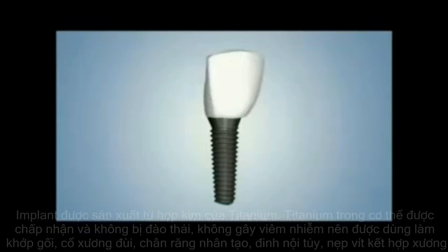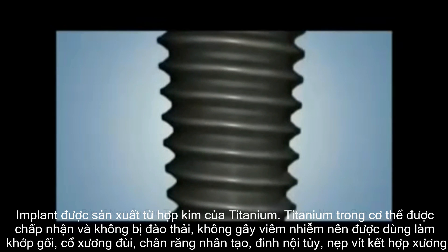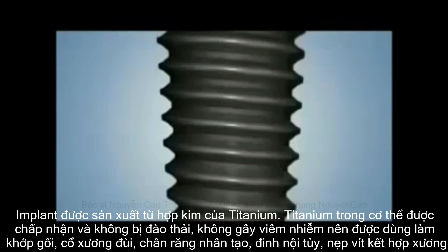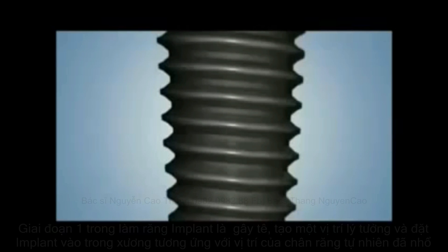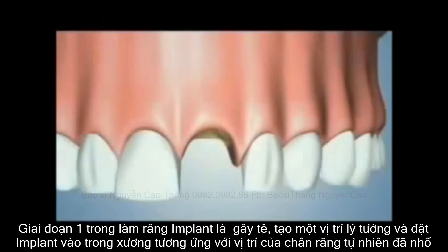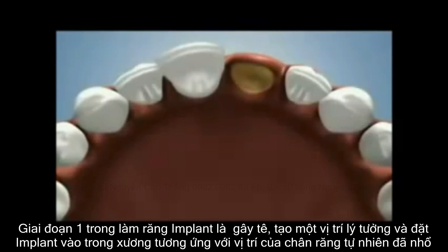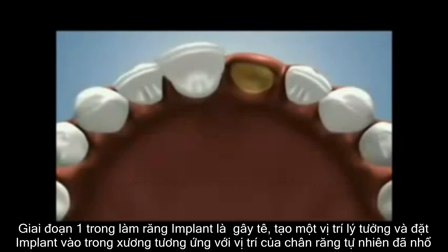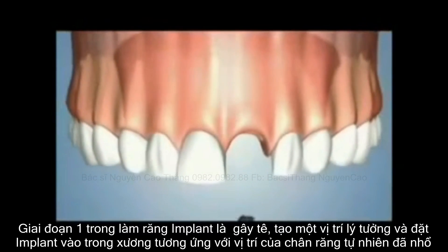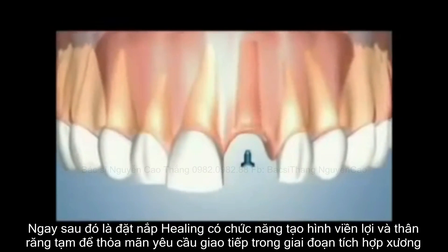Implants are made of titanium or titanium alloy. Unlike most materials, our body normally accepts titanium without infection. The first phase of implant treatment involves creating an opening in the jawbone in preparation for the implant. The implant is then placed, followed by a healing cover.